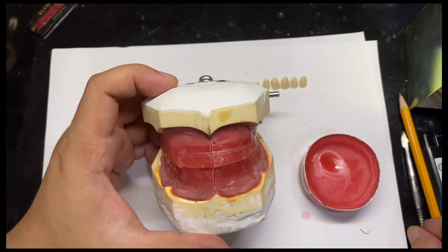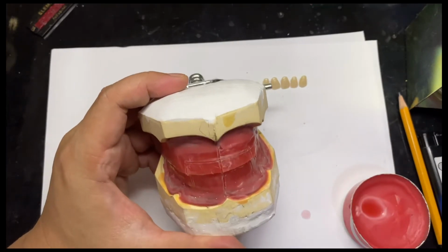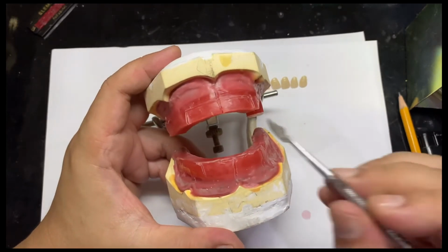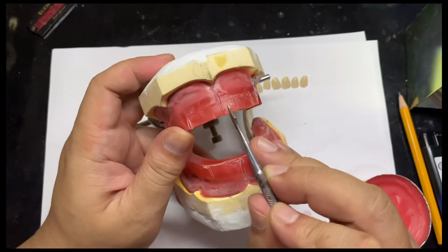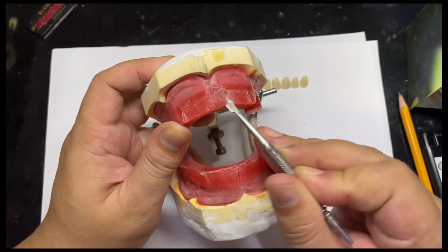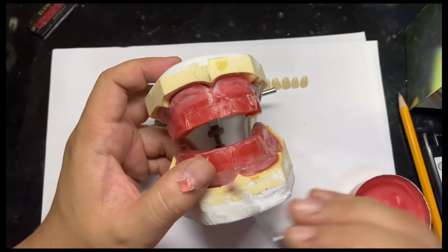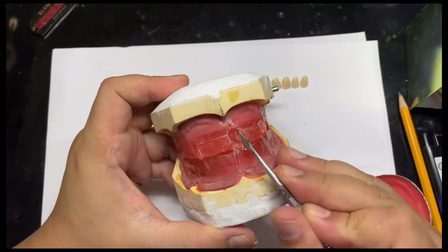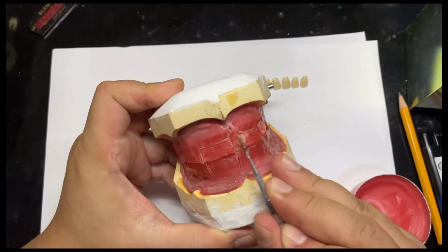And then second, I want you to cut a portion of the wax, just enough space for you to be able to set the central incisor. Cut this area. Of course, you have to maintain the midline. Always maintain the midline. That's why we extended the lines.